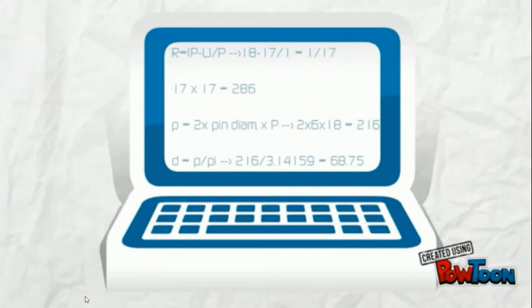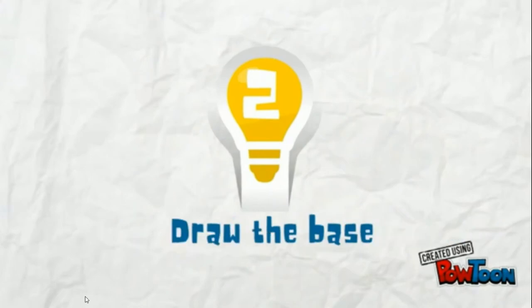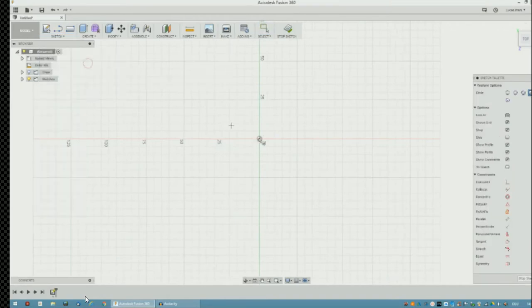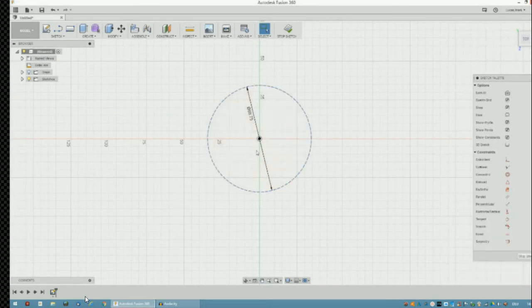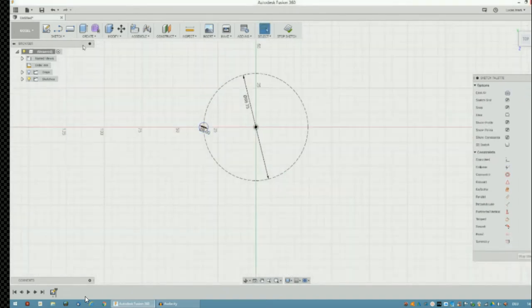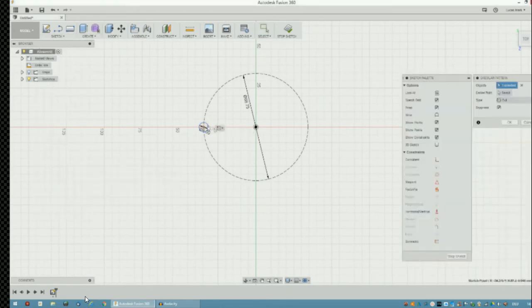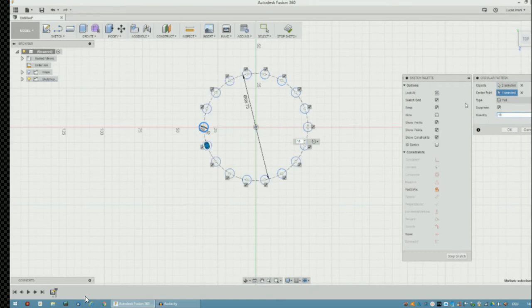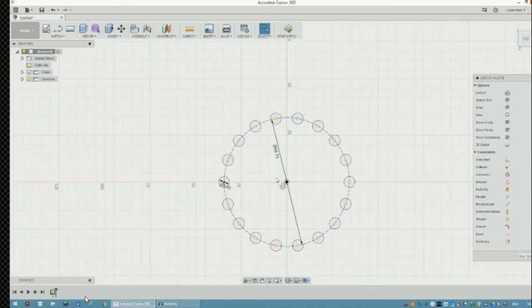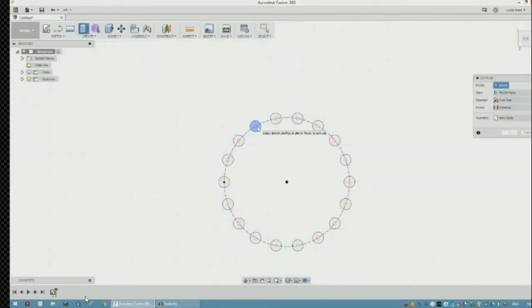So, now let's go ahead and do some CAD. First, we're designing the disc. So first, we're gonna draw a new sketch and draw our 68.75 circle. Then we are putting the diameter of 6 pins on the exterior and multiply them by 18 with a circular pattern. If you want basic information about Fusion, I have a playlist now on the info box that you can learn the basics. Now I extrude this.